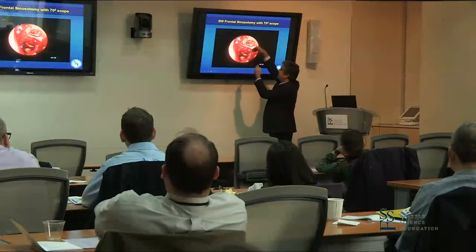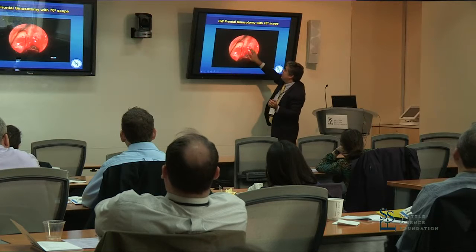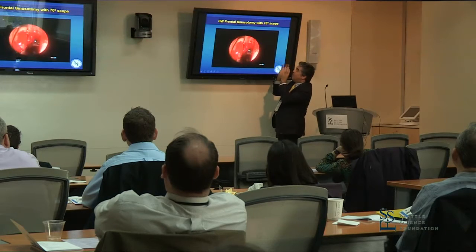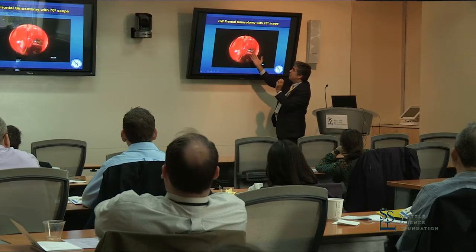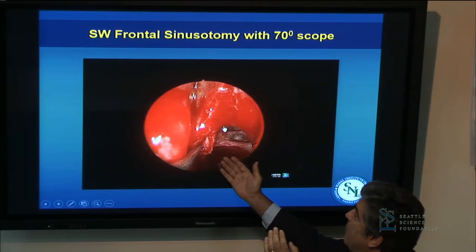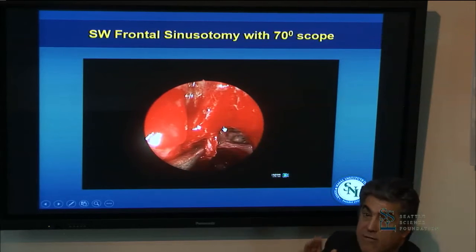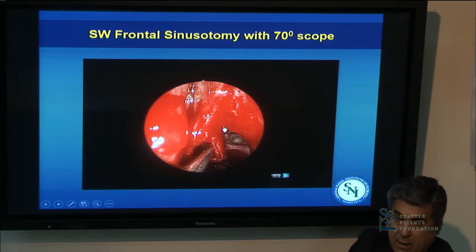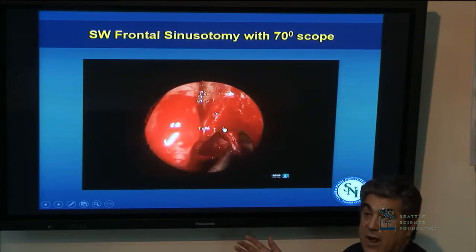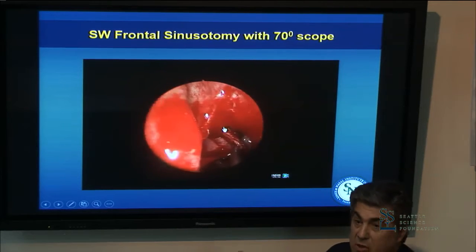Here's the maxillary antrostomy; the sphenoid is down in here. I'm using a 70-degree scope. This looks like a blind alley next to the middle turbinate as an uncinate process remnant. What I'm proposing is that you don't go from posterior to anterior, but once you get to the basal lamella of the middle turbinate, you come back to the front of the nose and do your frontal recess work from anteriorly. That's better and safer because you're less likely to get into an anterior ethmoid bleed, and you develop a broader view.